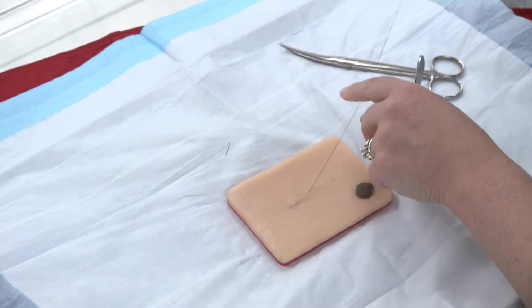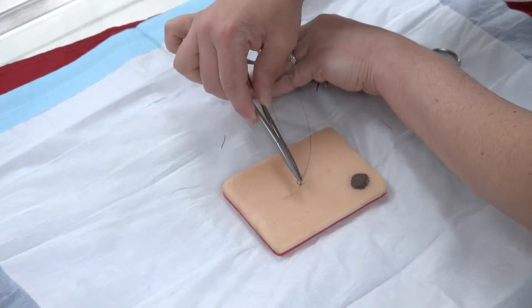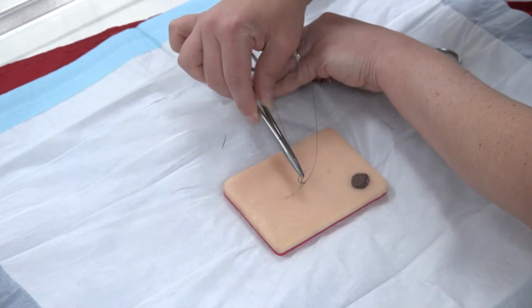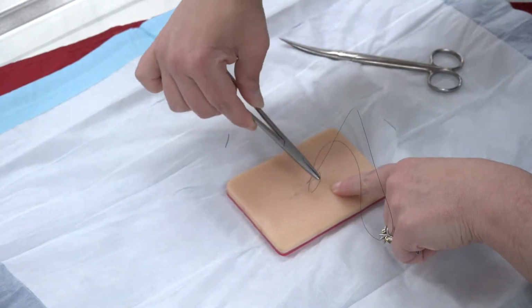Now, one other thing that people do is, see where I'm coming out right there? They'll come and their next throw, because they're stretching the skin, or their next suture will be down this way. And then that's not tight enough. So I'm going to put one in a little bit further down than it should be.